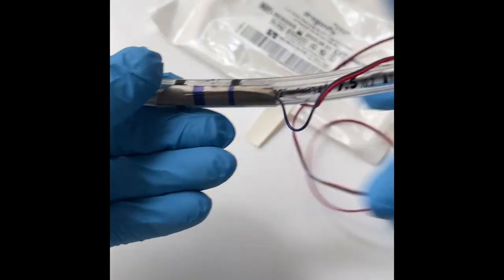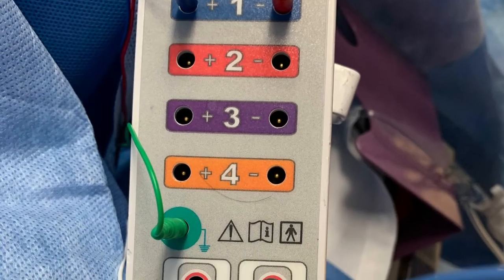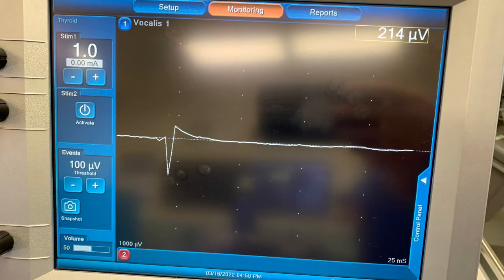Step 2: plug the red and blue leads into the same channel 1 port. The green needle and white needle should also be placed subdermal and plugged into the respective color-coded ports. Step 3: select the monitoring tab and tap the red number 2 box in the window to minimize and turn off channel 2.